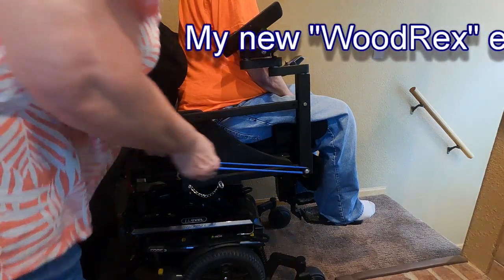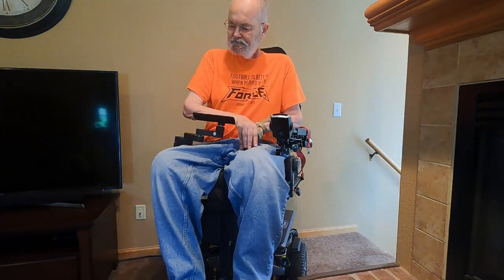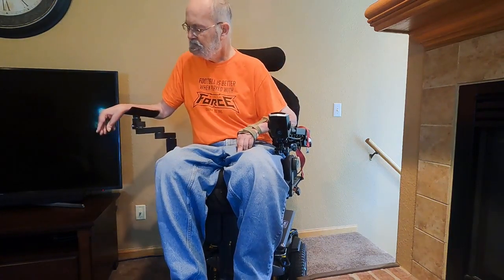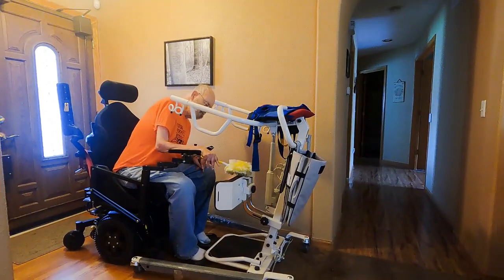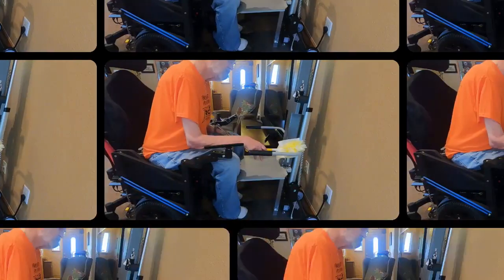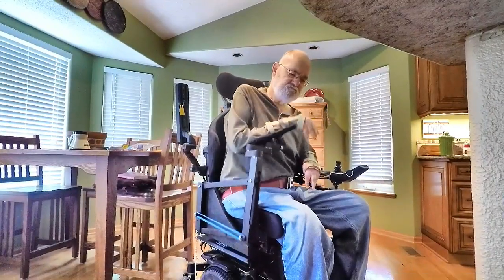So what can I do with this homemade wooden exoskeleton that cost less than fifty dollars to make that I couldn't do before? Without it, my forward reach with my right hand and arm was almost non-existent. Now with this homemade exoskeleton, I can not only reach forward, but can also swing it above the table level to the left and to the right. Depending on the number of resistance bands installed, my arm elevation can go quite a bit higher than just the top of the table. Perhaps there are a few cleaning chores around the house that I'll be able to do, and maybe I can keep my computer desk a little neater.